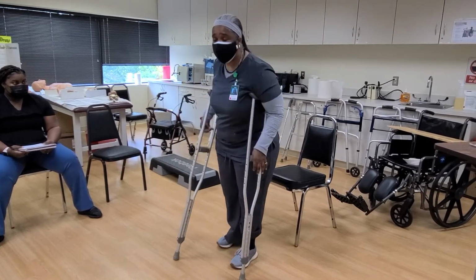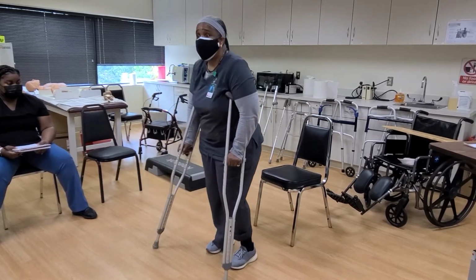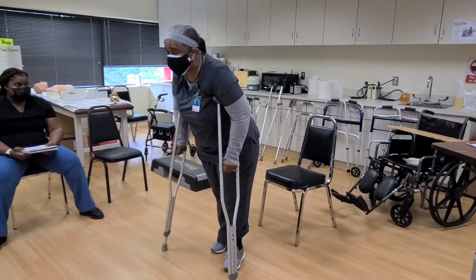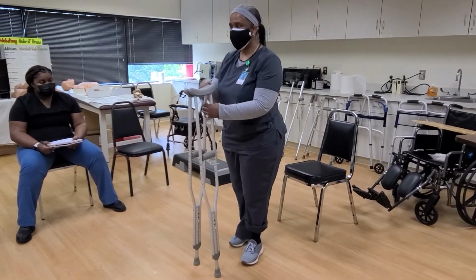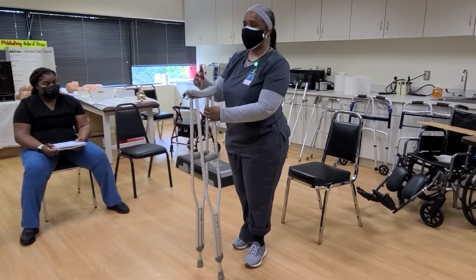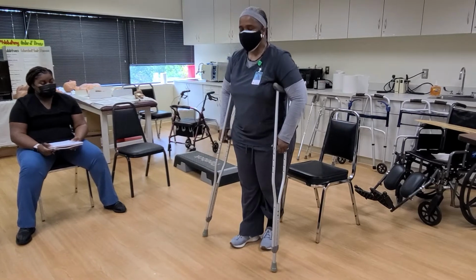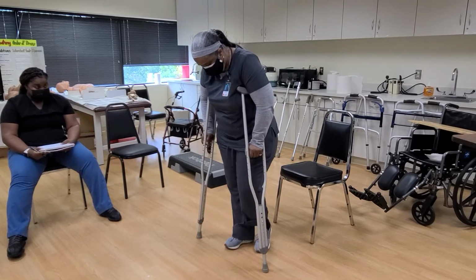I mean, I was wobbling, and a couple of people walking around were like, are you okay? And I'm like, yeah, no, because I had never walked with crutches since I'd never broken anything. I'd sprained ankles, but I'd never walked on crutches. So you really need to talk to your patients and ask them some probing questions before you give them something, or have the physician give them something, where they can actually hurt themselves, because I almost did hurt myself. So again, this is for somebody who has better balance, and is usually younger.